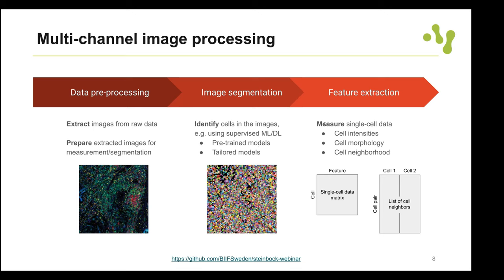That way you've already extracted your first single-cell data from multiplex tissue images. Other things one can measure include morphology, using the 'steinbock measure regionprops' command. By default this computes area, centroid, major/minor axis, and eccentricity of each cell. You can also explicitly specify properties — for example, just area and centroid — by adding those to the command.